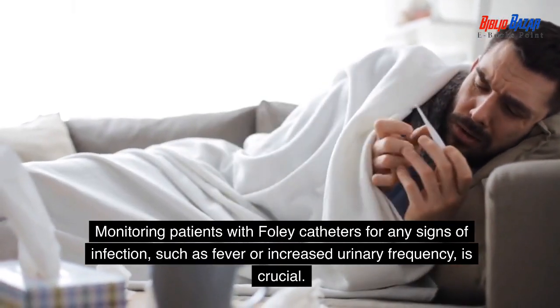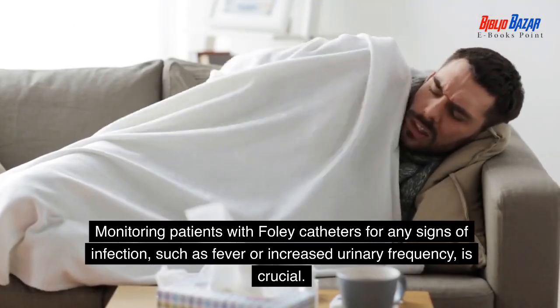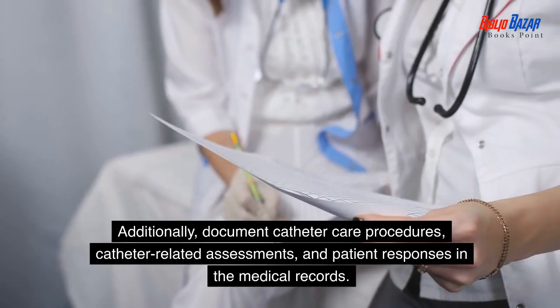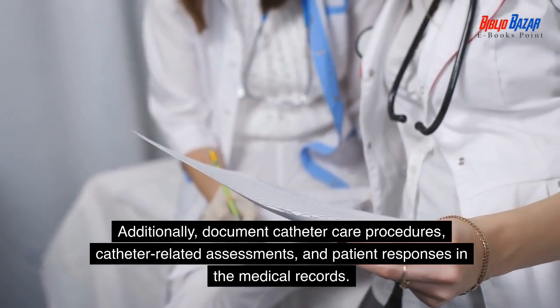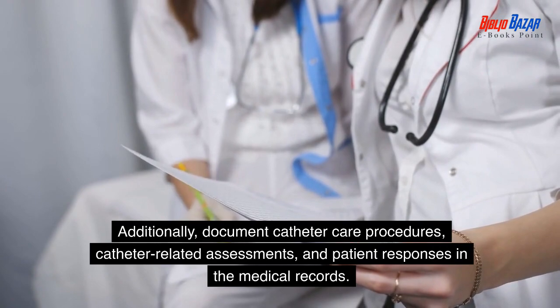Monitoring patients with Foley catheters for any signs of infection, such as fever or increased urinary frequency, is crucial. Additionally, document catheter care procedures, catheter-related assessments, and patient responses in the medical records.